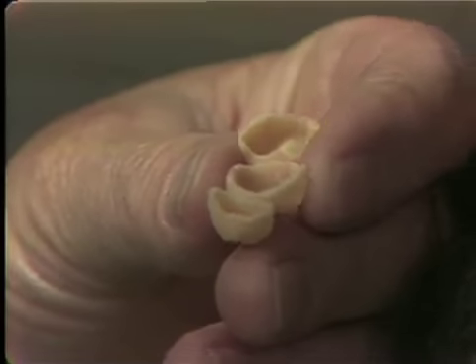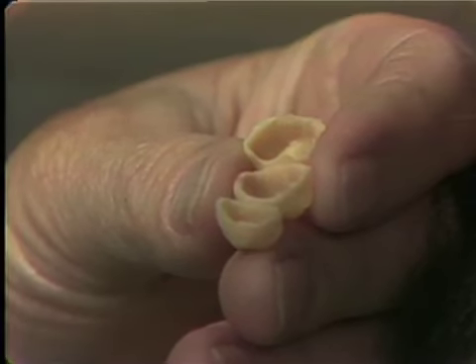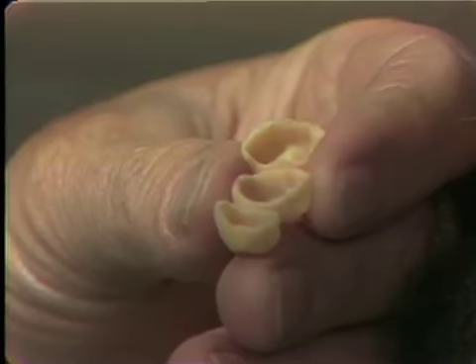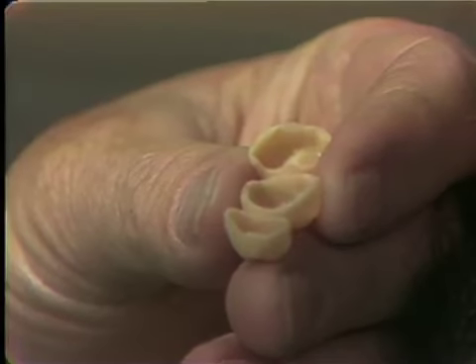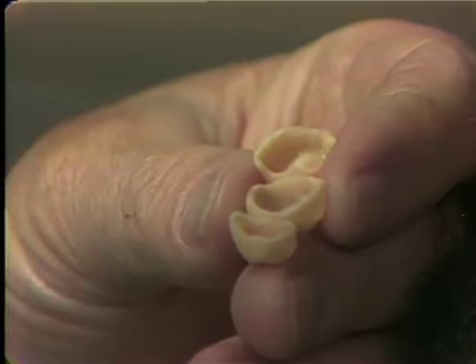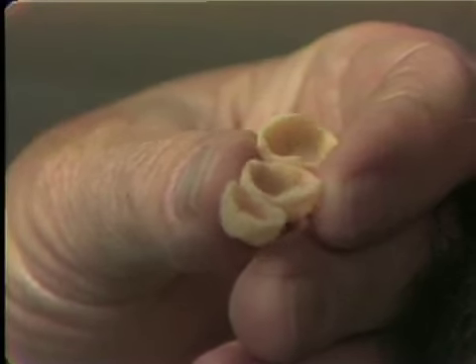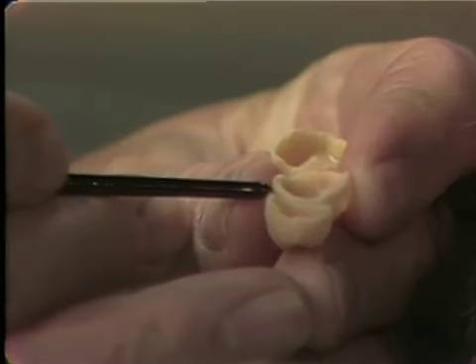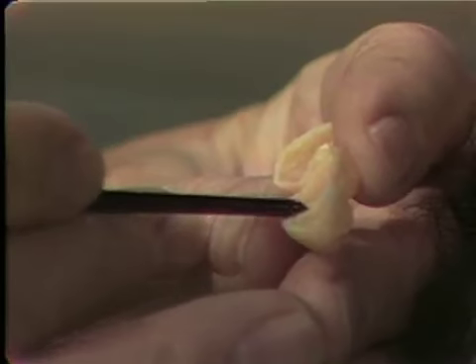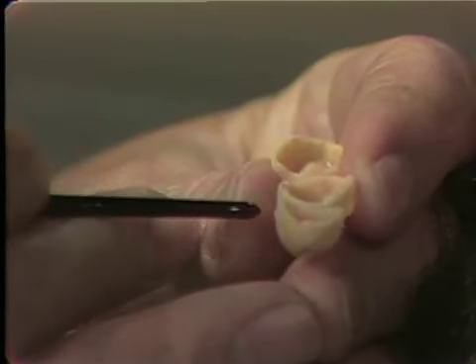The areas of extreme importance of the temporaries are the margins, the embrasures, and the occlusion. The embrasures are important so that the interproximal tissue can be maintained in a healthy state. The embrasures should be opened, as I pointed out earlier, to give room for the tissue to exist.